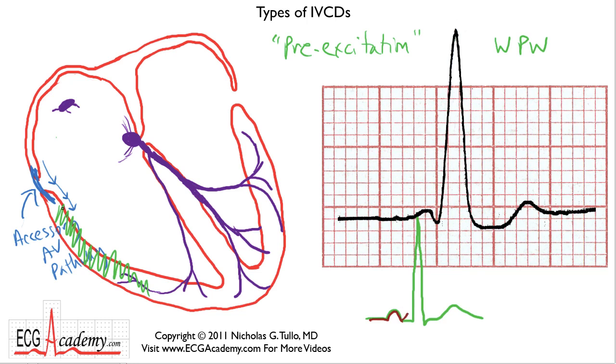And because you're not using the Purkinje system, and that conduction occurs very slowly through these cell-to-cell connections, the QRS complex is not sharp in its upstroke, but rather slurred. And so the QRS is generally wider than it should be, and then there are often T-wave abnormalities that go along with it. In essence, what happens is the QRS widens at the expense of the PR interval.